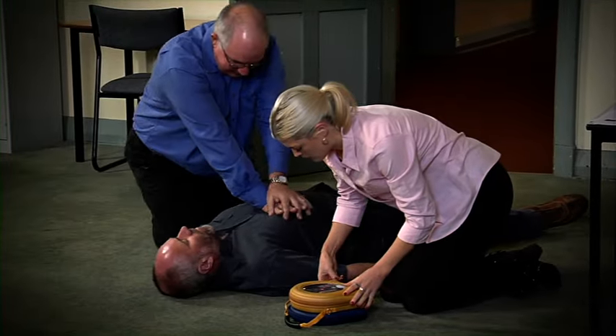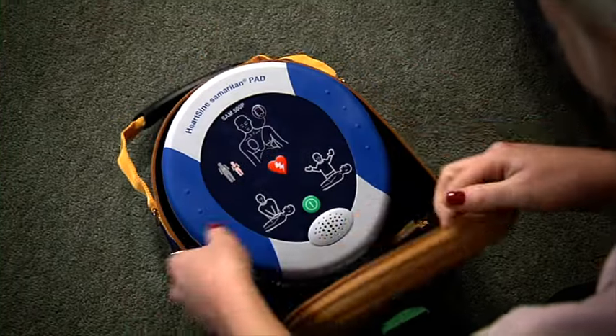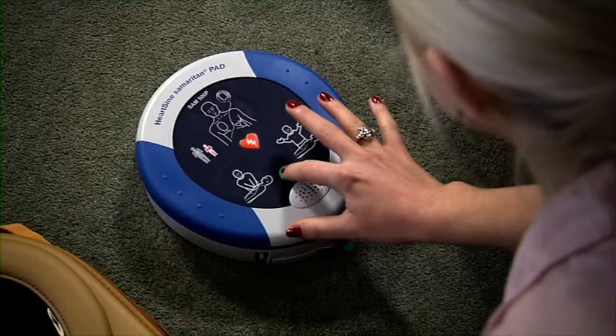Remove the AED from its carry case, switch it on and follow the voice prompts and instructions.